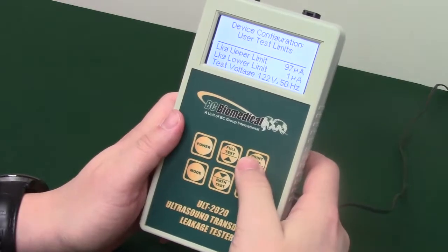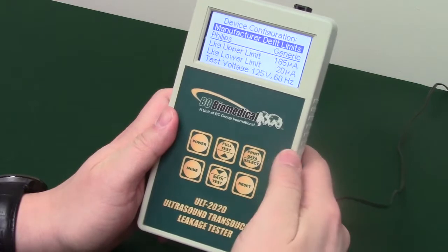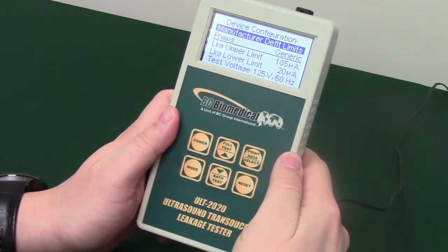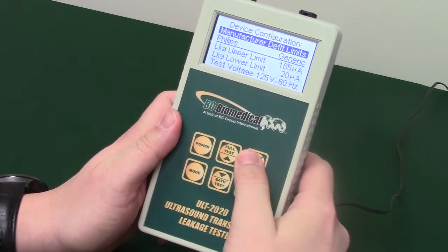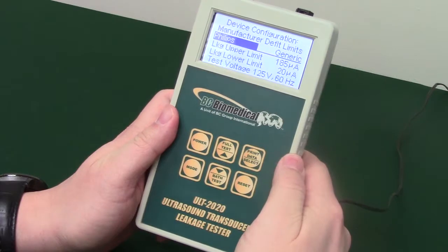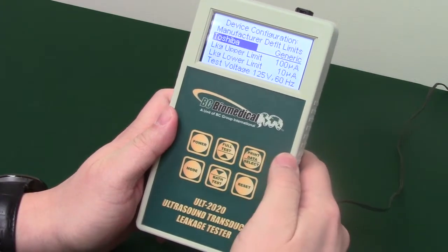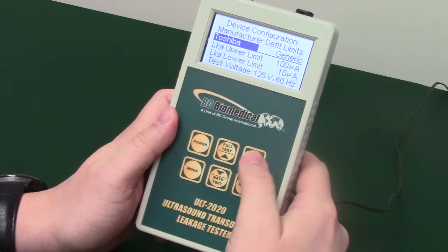Use the arrow keys to access the third setting, Manufacturer Default Limits. These limits are pre-programmed into the ULT by BC Group and meet the requirements of four different manufacturers. Use Select to scroll through the limit settings, Manufacturer, and Probe type. Use the arrow keys to change your selection.